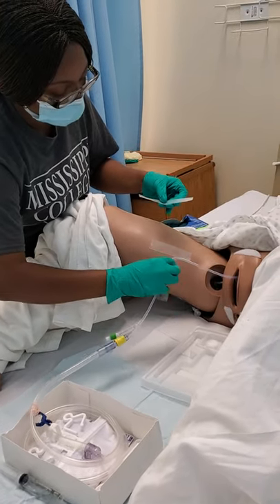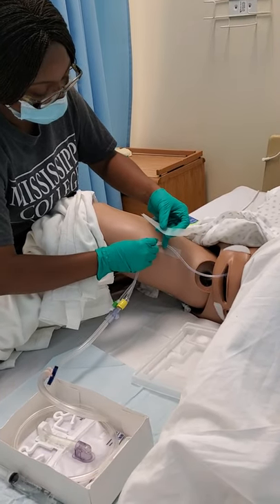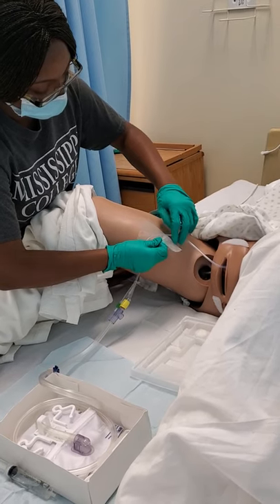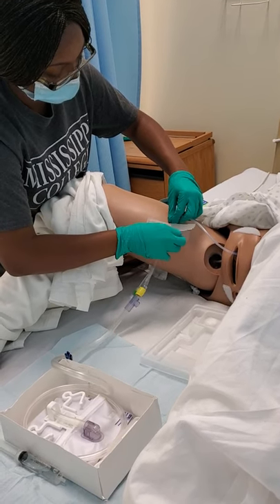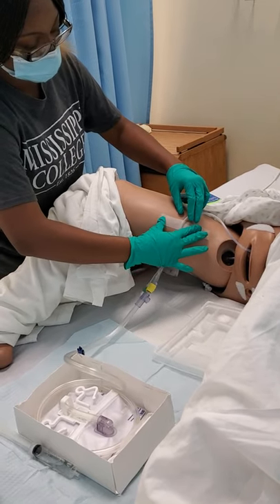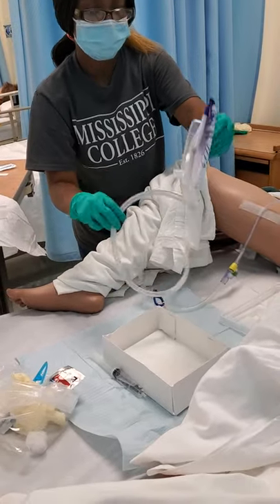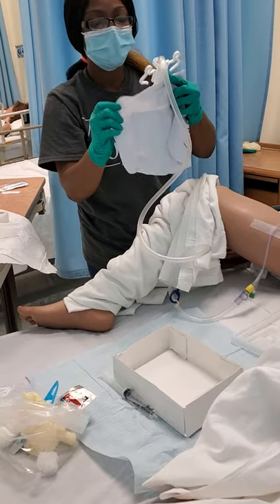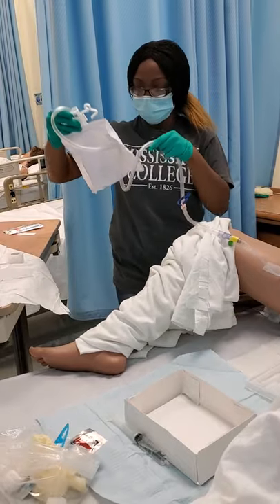Now I'm going to secure this to her leg, but I'm going to make sure that there's enough room for her to move. Okay, now I'm going to take the bag and I'm going to put it on the bed frame, not the bed rail. And I'm going to make sure that there is urine in the bag.